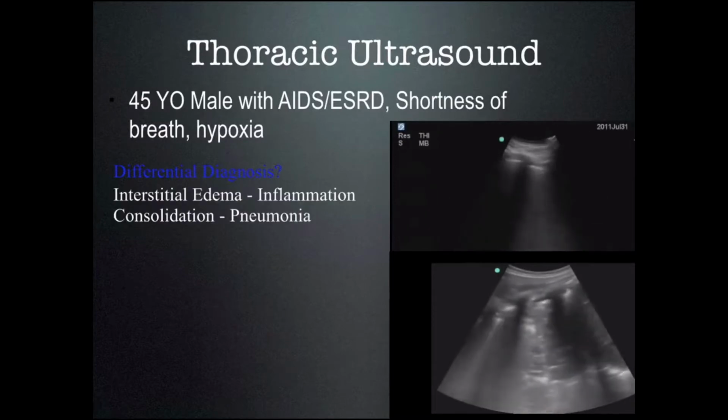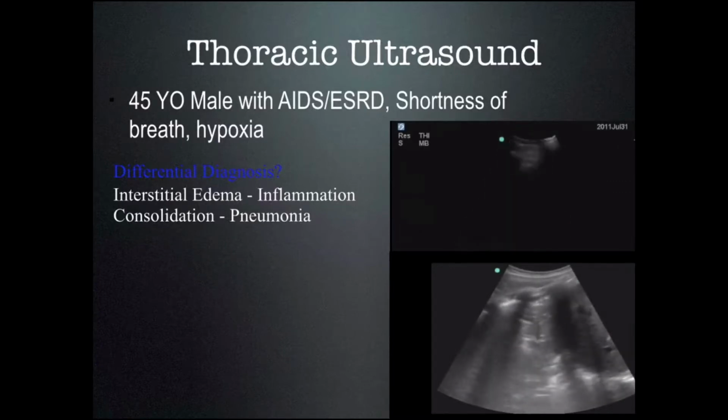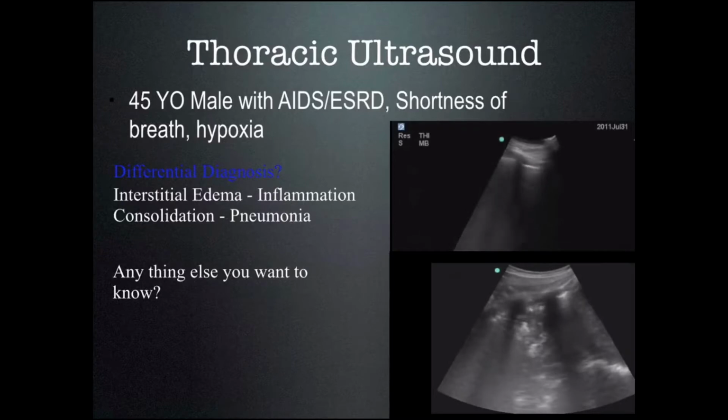It's a pneumonia. So what do the lung rockets represent? They represent interstitial edema, and in this case, that's inflammation. But we also found his pneumonia. But what else do we want to know? Is there anything else you want to know about this patient?